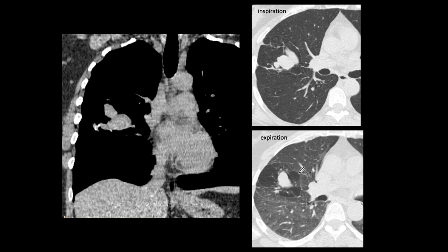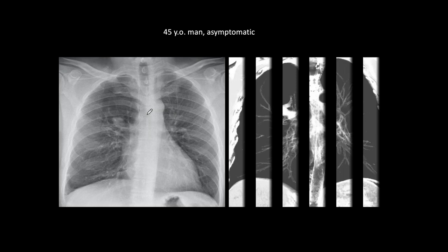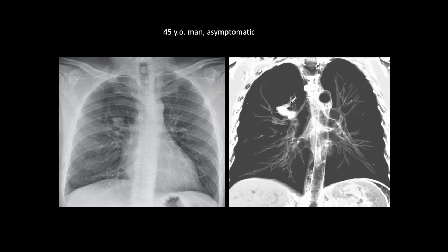If you want more confirmation you can do a bronchoscopy to eliminate any other possible cause. Another case: a 45-year-old asymptomatic man. At first glance you see a sort of emphysema in the right upper lung — a hyperlucent area compared to the left with very limited vasculature. But in the middle there is a nodule, which represents mucus impaction. You are not going to make the diagnosis on the plain film, but you can suspect it and confirm with CT. There you have the absent bronchus and mucus impaction inside, and the hyperlucency of the upper segment — that is congenital bronchial atresia.